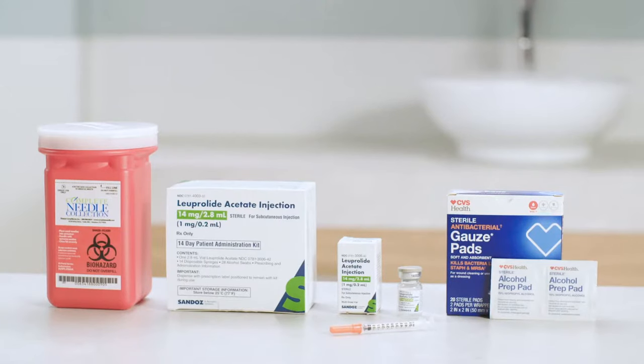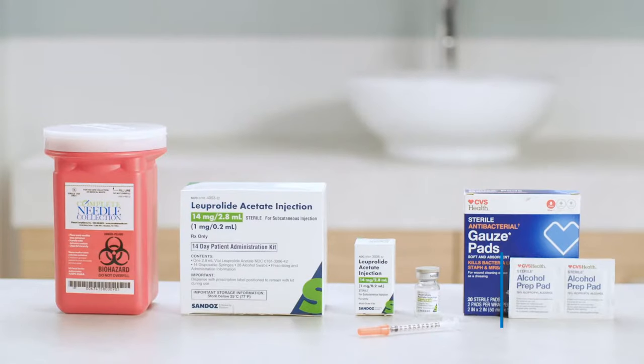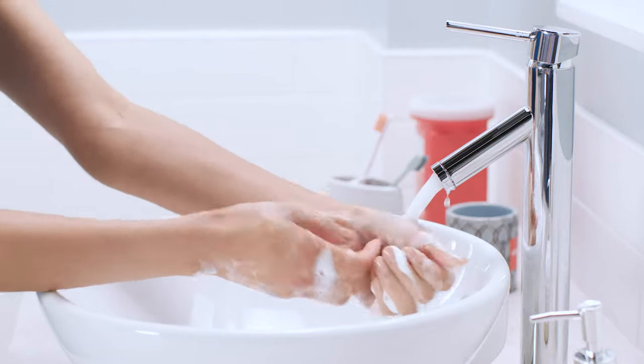Let's start by making sure you've got all your supplies ready to go: a multi-use vial of Lupron, also known as Leuprolide acetate, a syringe marked in units with attached needle, plus alcohol pads, a gauze pad or cotton square, a sharps container, and a clean surface. Now go ahead and wash your hands really well with soap and water.